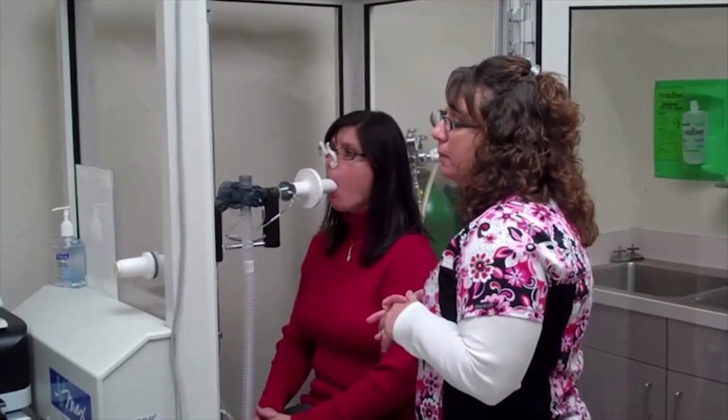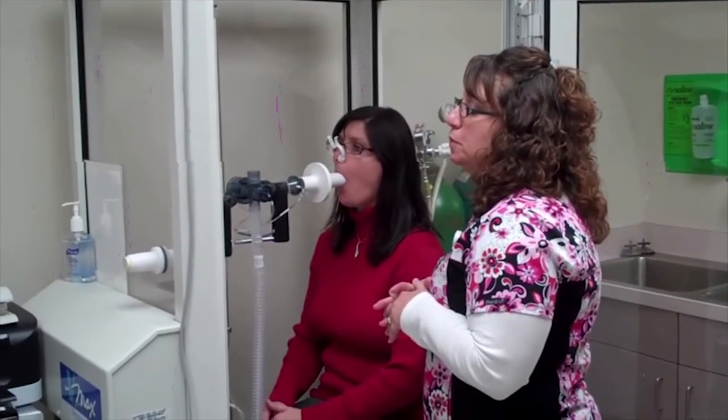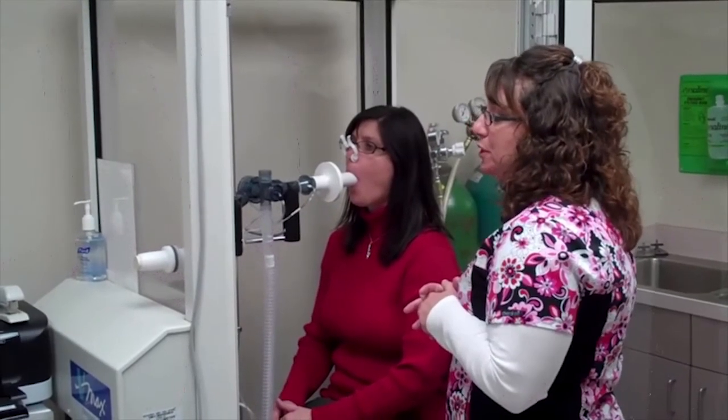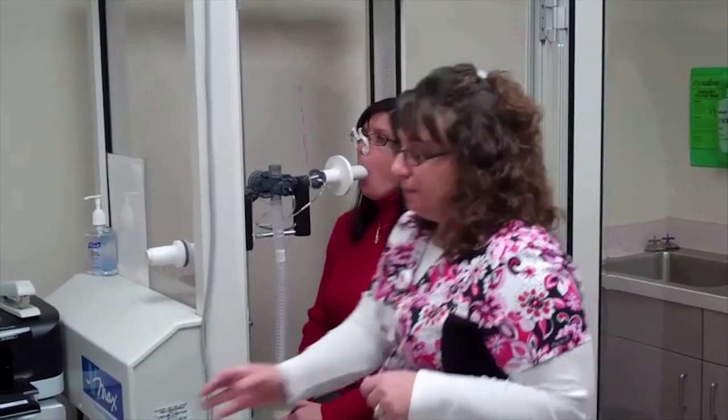Okay, big breath in for me. And blow. Push, push, push, push. Big breath in real quick. Good job.